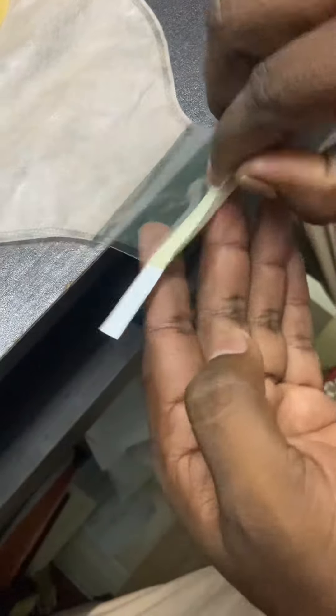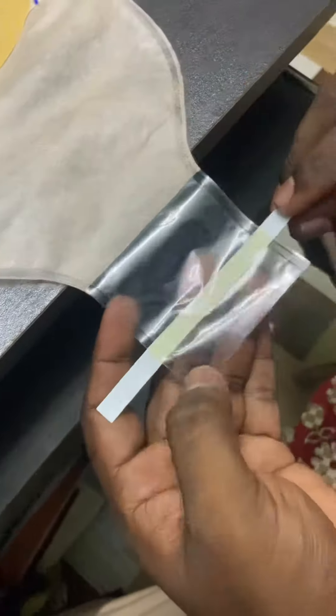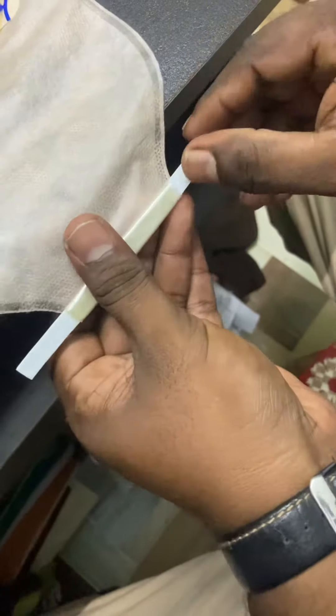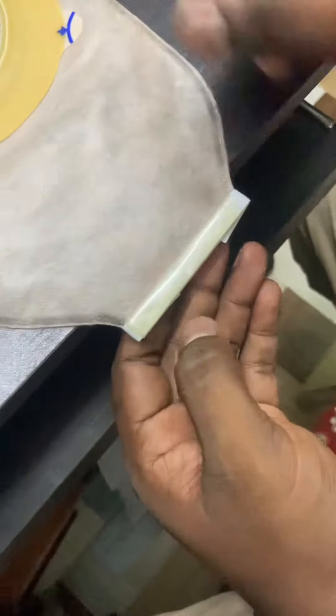Please put it beneath the opening of the bag, and it is fixed. Then you can fold it like this.